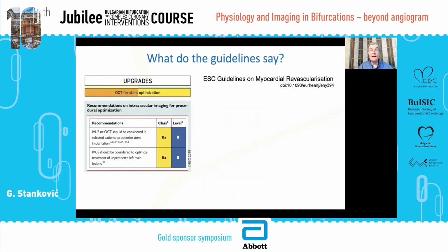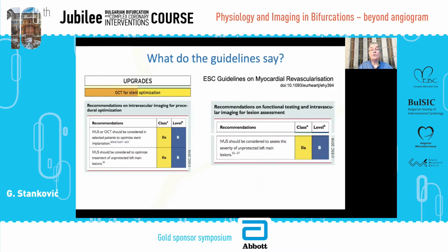What do the guidelines say? We have upgrades, and we are expecting even more as data are collected for both imaging modalities, IVUS and OCT. For OCT stent optimization, there is an increase from class 2B to class 2A regarding selected patients to optimize stent implantation.